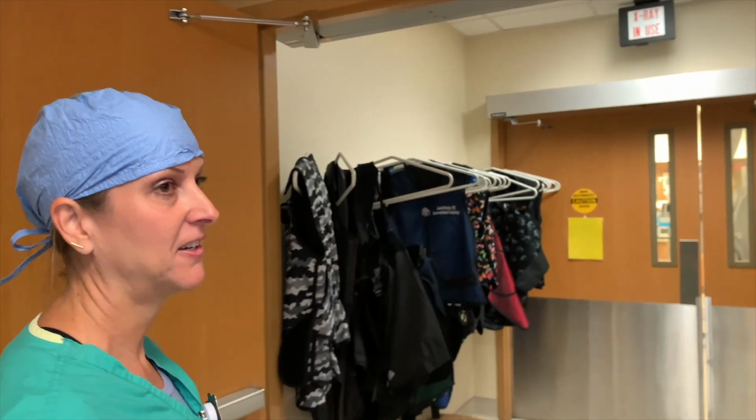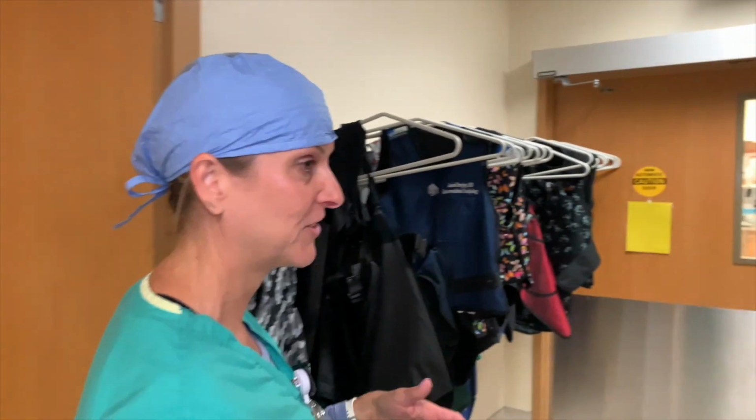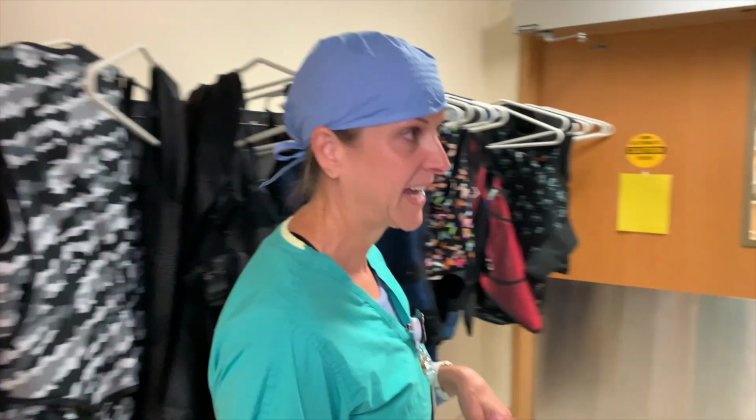I like to go in there and get the patient's history and talk to them, like, hey, where are you from? Especially when they're super nervous, because believe it or not, when you're having a heart attack, you're wide awake. So we're gonna roll you in awake. You're gonna be talking to me just like now, hopefully. So I try to alleviate your stress: where are you from, how many dogs, cats, kids you got. Just focus on me and what we're doing, and that makes them relax a little bit.